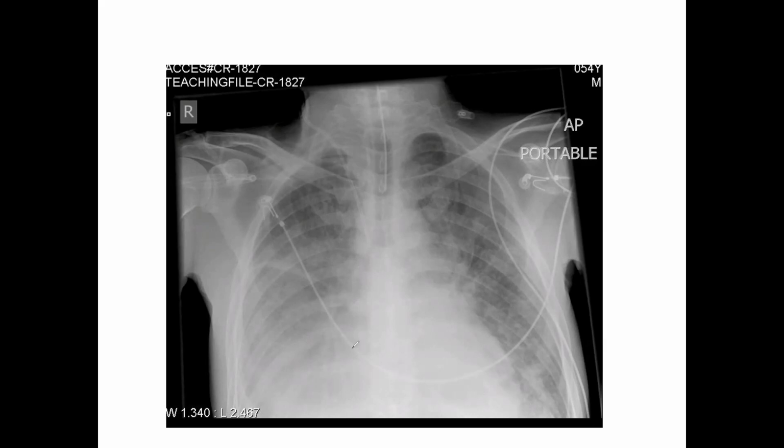So it's hard to look definitively at the entire base of the lungs, what have you. But some important things can still be picked out from this. So you can see that you've got an increase in haziness, some infiltrates and so forth throughout. So although the lung tissue is aerated, it could be aerated a little bit better. We're going to also see the trachea, so I'll outline the trachea again.